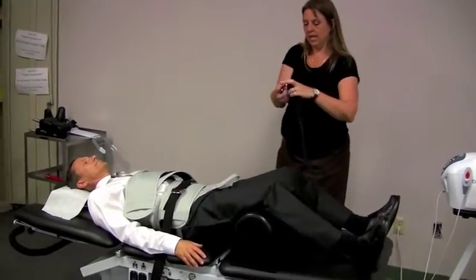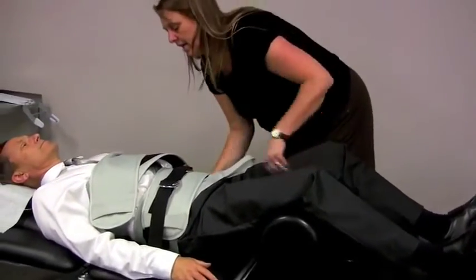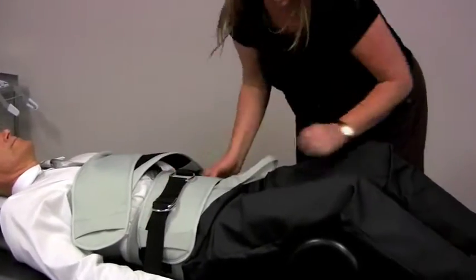This next part is where I've got to take this hook and attach it to the ring. Again, the ring has gone a little bit off center, so I'll put it back into center again.